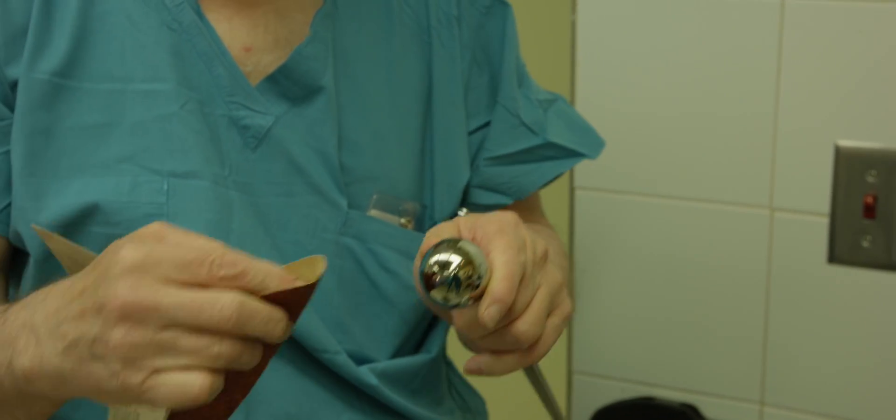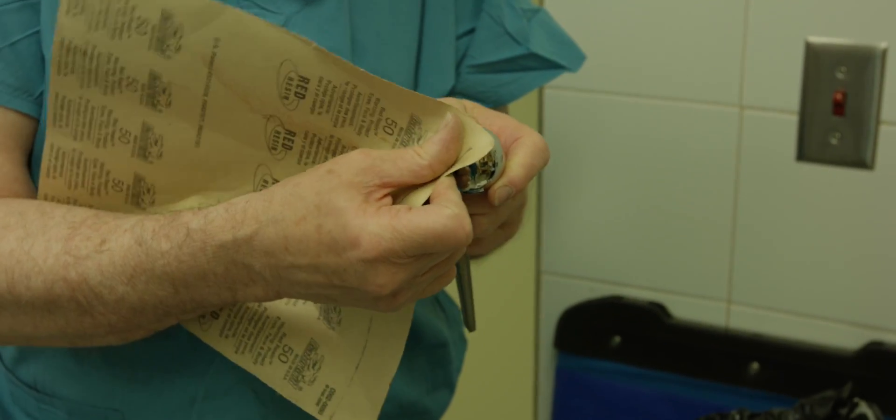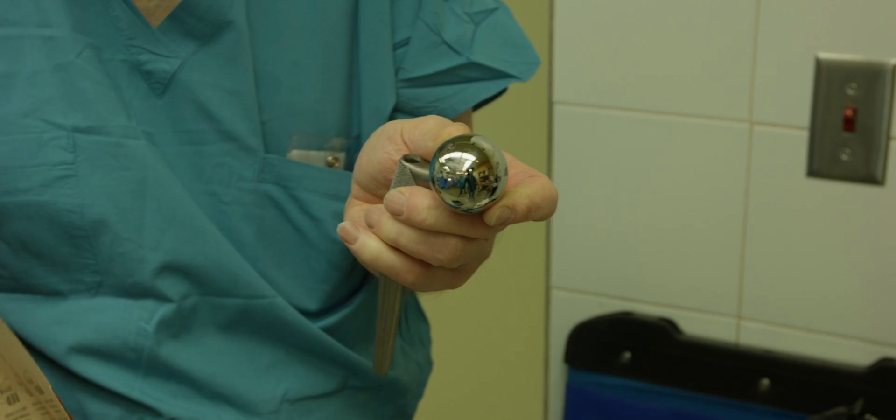Stryker standard hip, cobalt chrome head. Yeah, there's the mark.